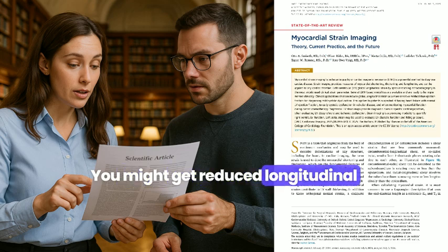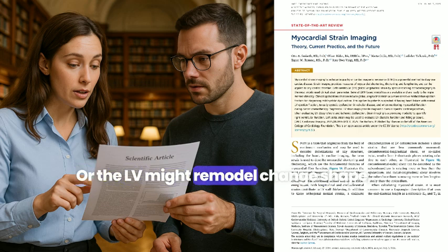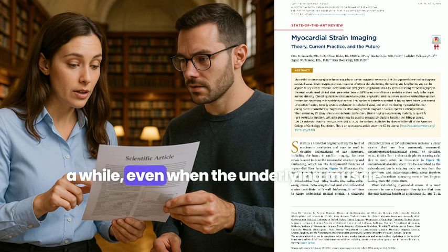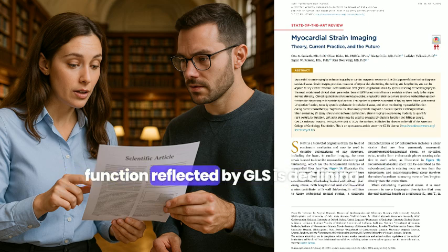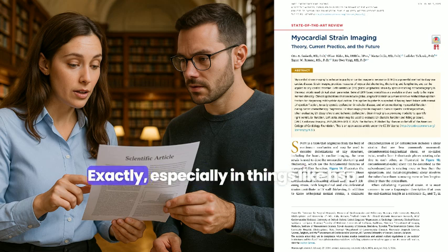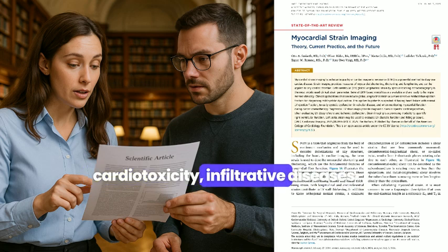You might get reduced longitudinal shortening, but maybe increased radial thickening, or the LV might remodel, change shape, which can preserve the overall EF for a while, even when the underlying muscle function reflected by GLS is declining. So GLS unmasks problems EF might hide initially. Exactly, especially in things like HFpEF, hypertensive heart disease, early cardiotoxicity, infiltrative diseases.